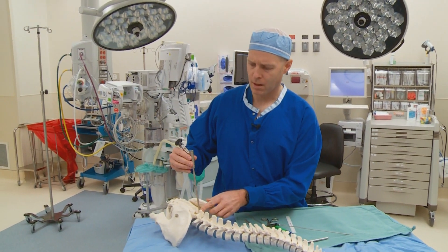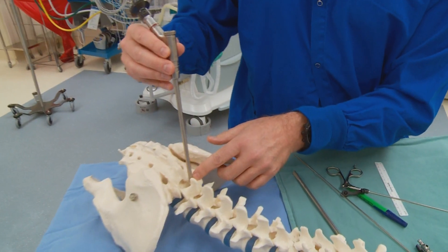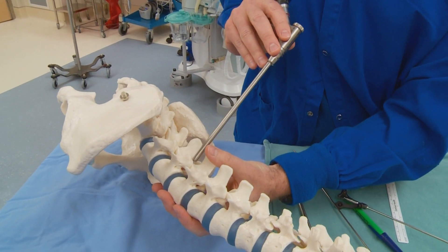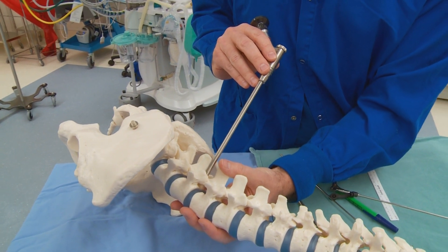They'll work next to the nerves; we move the nerves out of the way, down to where the disc space is. You can see here the discs are the blue areas here, and we're able to move the nerves out of the way and remove disc material that's herniating.